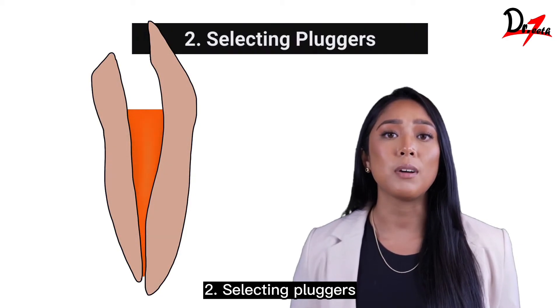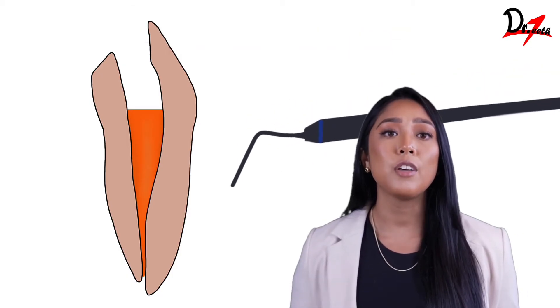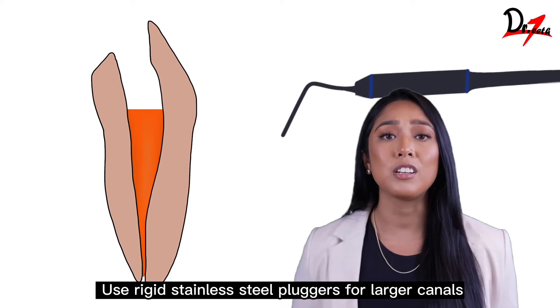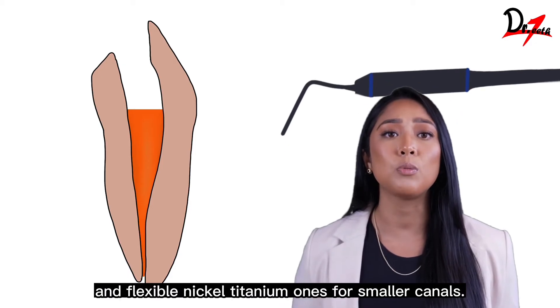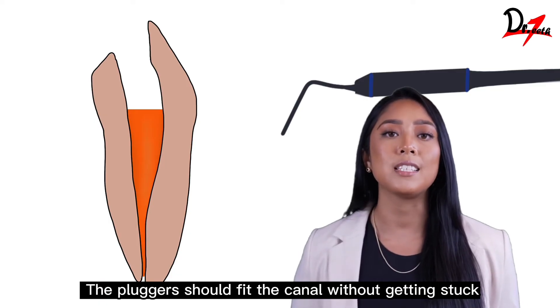Stage 2: Selecting pluggers. Use different size pluggers for vertical compaction. Use rigid stainless steel pluggers for larger canals and flexible nickel-titanium ones for smaller canals. The pluggers should fit the canal without getting stuck.